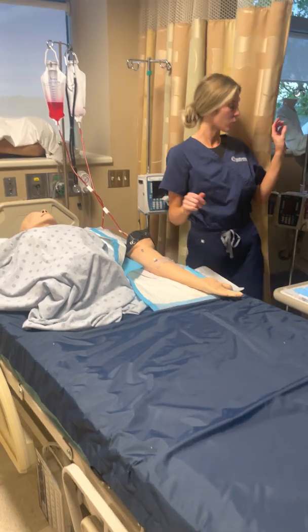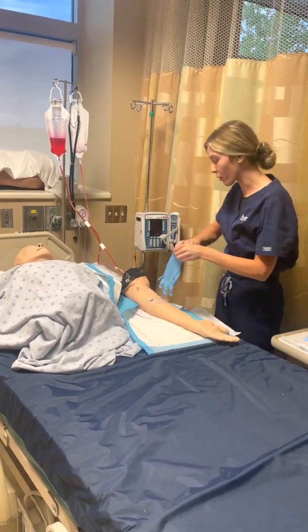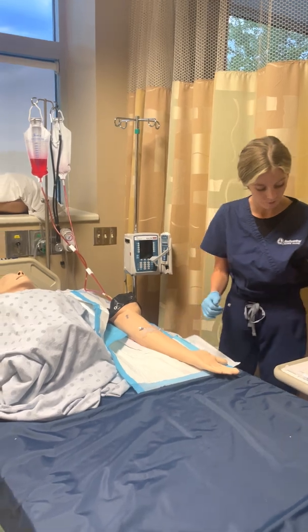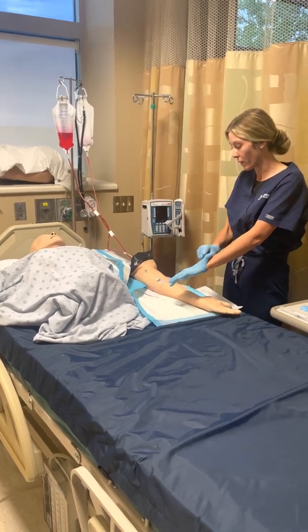I have the bed at a nice working height here, and I'll just provide for privacy. So just a couple things first. Can you confirm your first, last name, and date of birth for me, please? Betty Jones, 05/21/1952. Perfect, and thank you, Betty. And do you have any allergies to anything? I do not. Okay, no allergies.